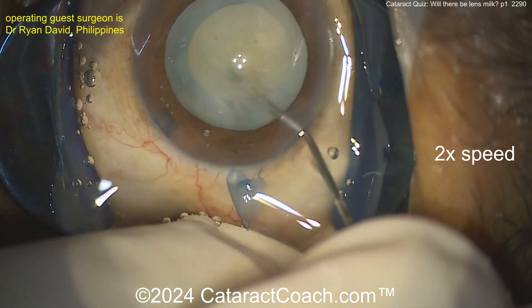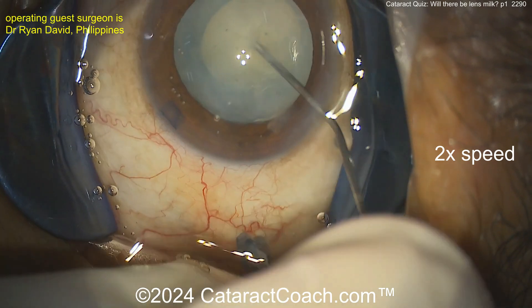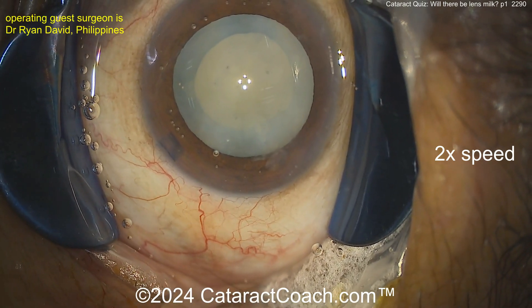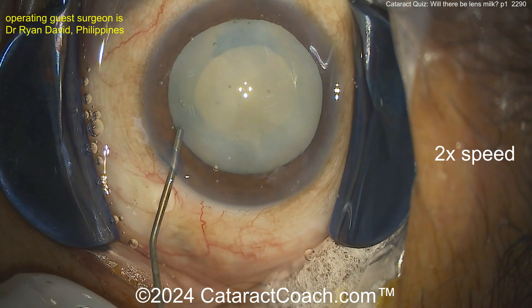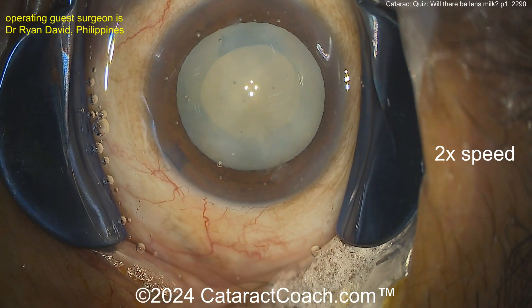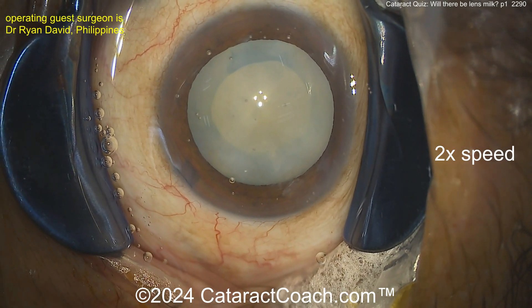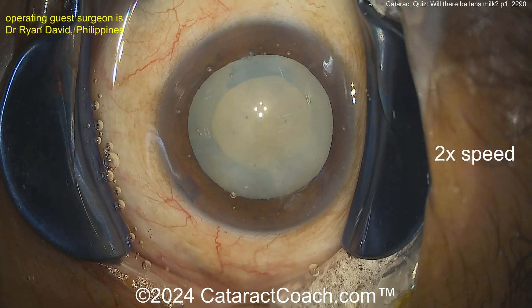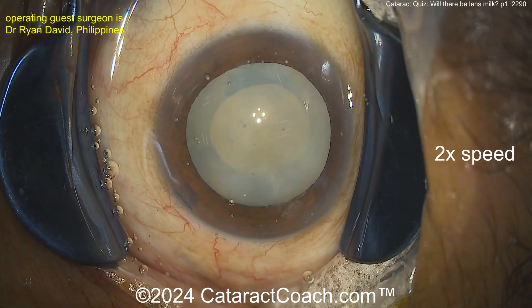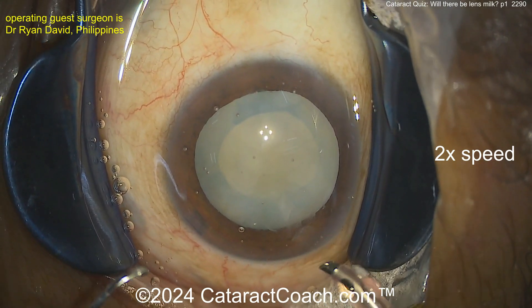Now a little bit of hydrodissection - we'll finish the rest of the cataract case. Tomorrow is also a cataract quiz part two, the same challenge: look at the case tomorrow and can you tell the difference? If you're a young surgeon, a beginning surgeon, a resident surgeon, I'm teaching you some magic here. This is really good stuff - we're going to learn what are the things that help us identify ahead of time that there could be danger.